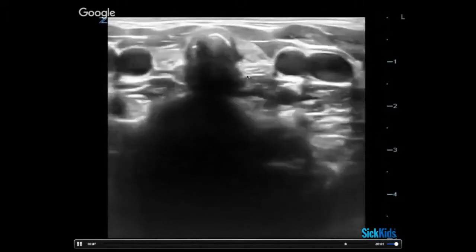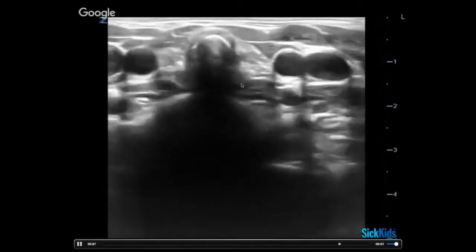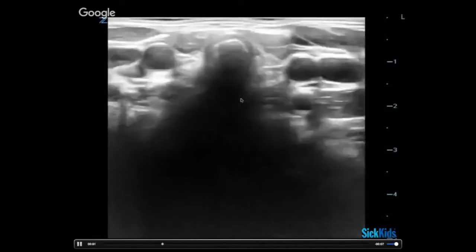As a rule it tends to pop out to the left more so, like we saw in the last picture, but it can really show up on either side. There's no hard and fast rule about where you're looking for it, other than to say that anatomically it's clearly behind the trachea. Depending on the pressure you use and how you're putting the pressure on, it can kind of move from side to side. If you're putting very little pressure on, sometimes it's completely not seen.